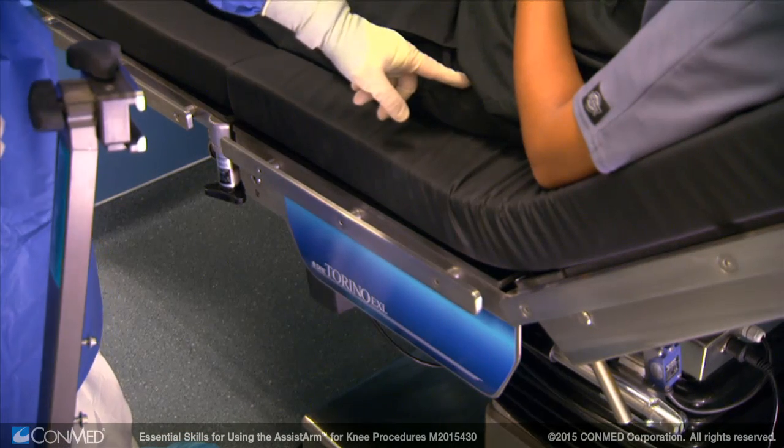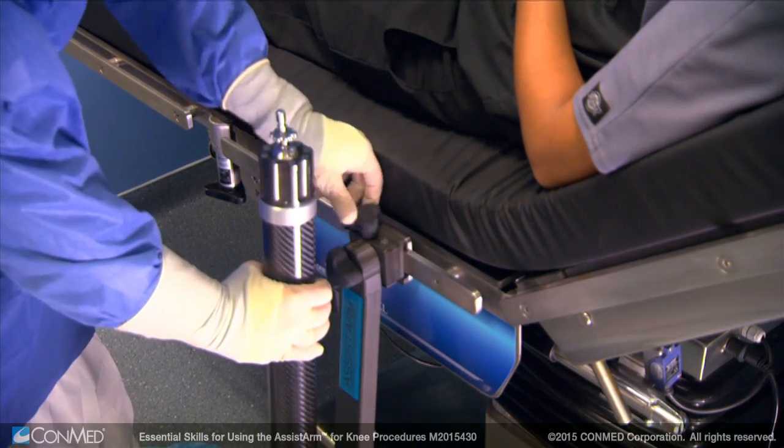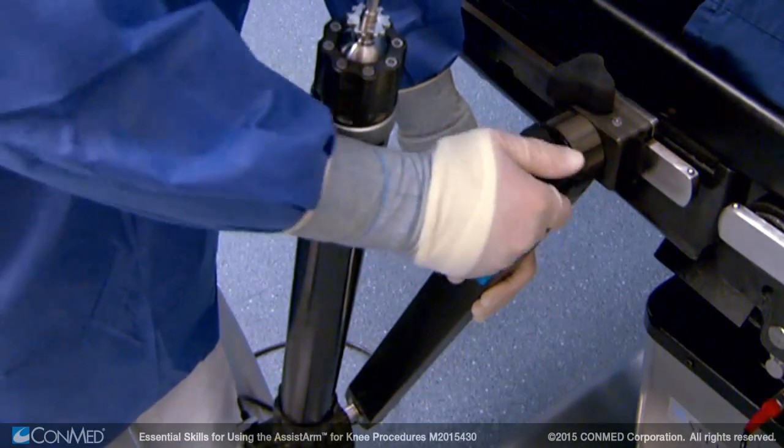To begin, install the Assist Arm on the surgical bed near the patient's hip, with the fixed arm angled towards the patient's feet. You can drape the Assist Arm in two different ways.